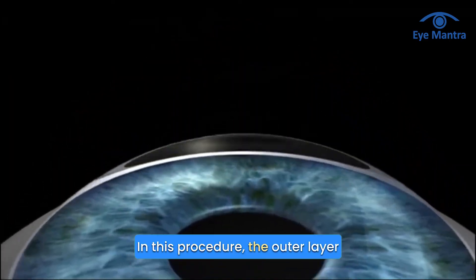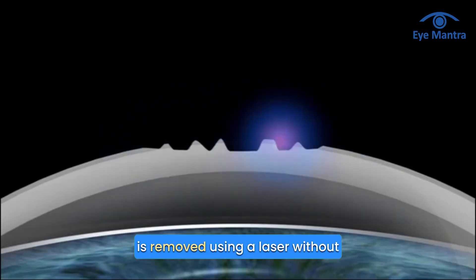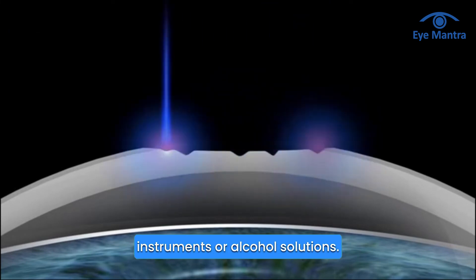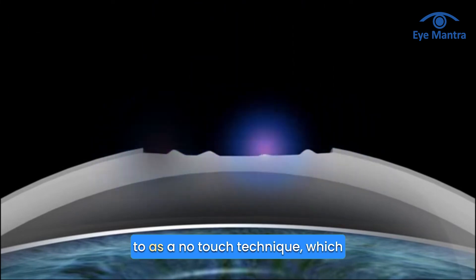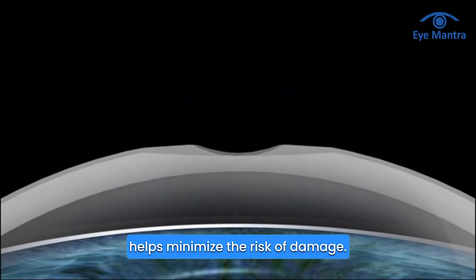In this procedure, the outer layer of the cornea, the epithelium, is removed using a laser without the use of any mechanical instruments or alcohol solutions. This is why it's often referred to as a no-touch technique, which helps minimize the risk of damage.